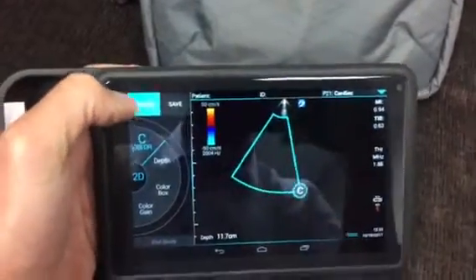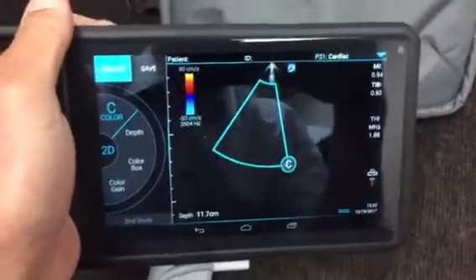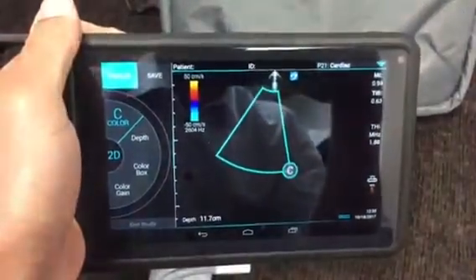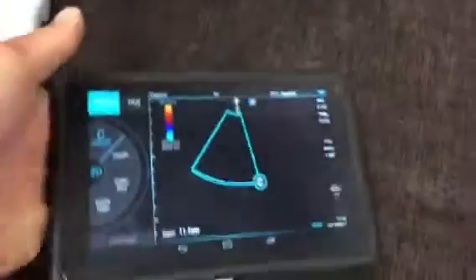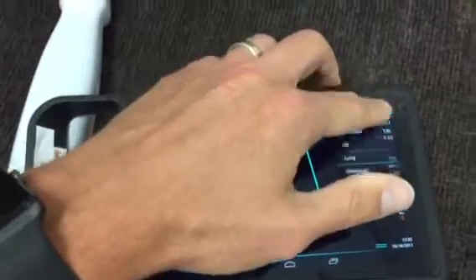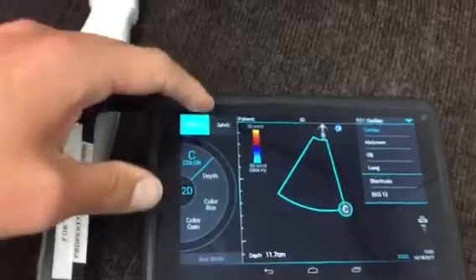Of note, this machine does not have pulse wave or continuous wave Doppler, which may not come as a total surprise. You can note in the upper right-hand corner the scanning type is cardiac. You can take your other hand out and press on this to change the type of scan quite easily as well.